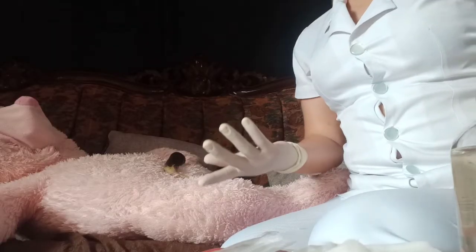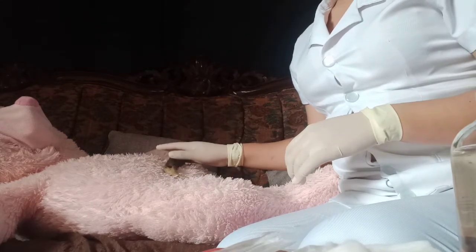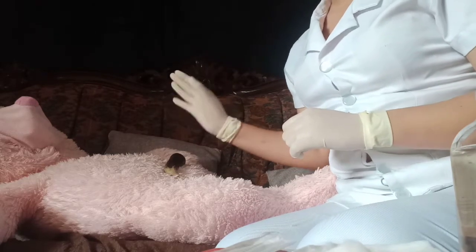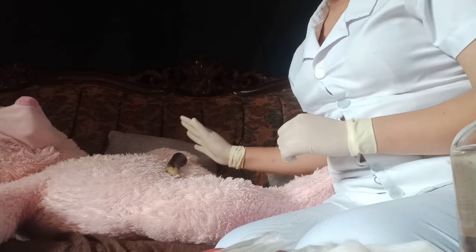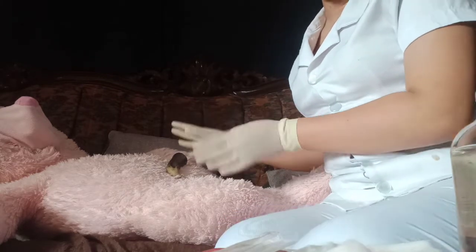So now we're going to select and clean the site. I'm choosing the lower abdomen to put the medication. Then select a site free of tenderness, hardness, swelling, itching, burning, or localized inflammation. Select a site that has not been used frequently. If you notice any of these, you can find another site to inject the medication.